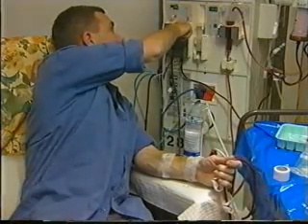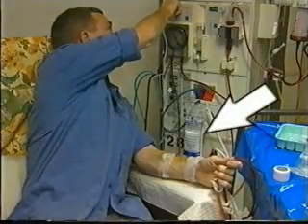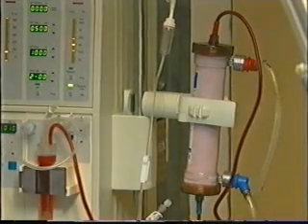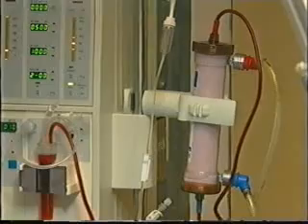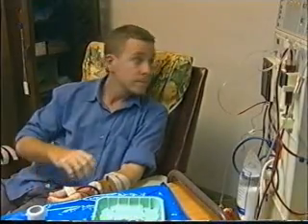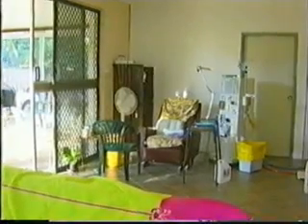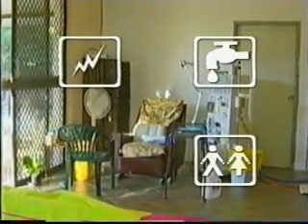Now we'll follow the tracks of the cleaning. The machine takes cleaning liquid from these bottles, takes them very close to the blood inside the filter, and sucks the rubbish out. Dirty water goes down into the sewage. There is no blood that goes into the sewage, and there's no blood that goes into the machine. So, to run a machine at home or in a clinic, you need power, water, sewage, and a phone line for help.